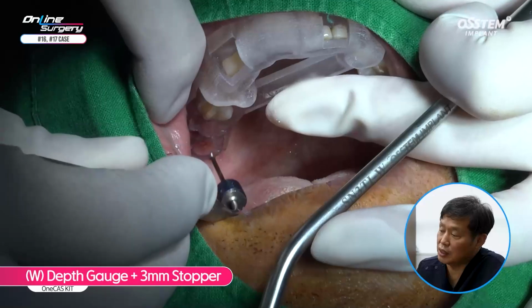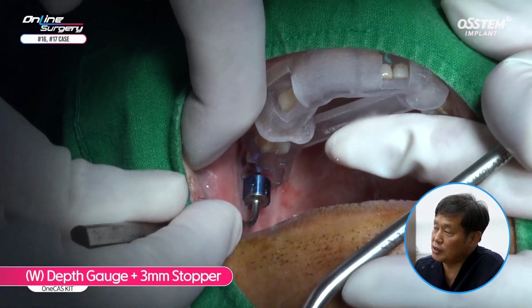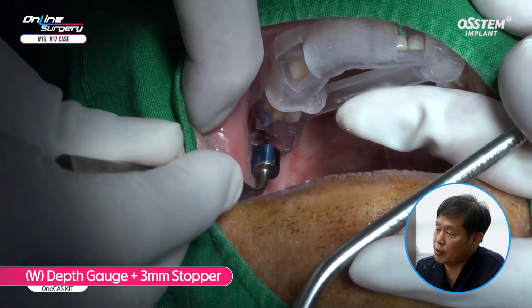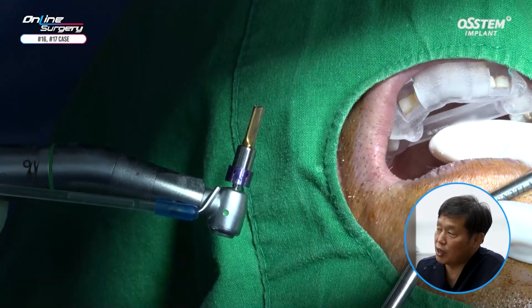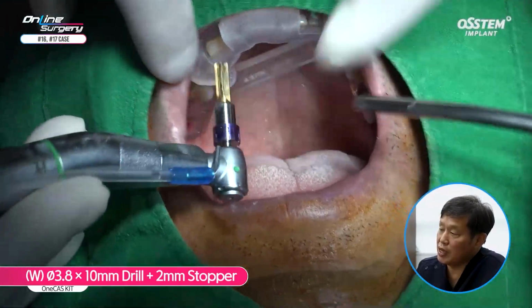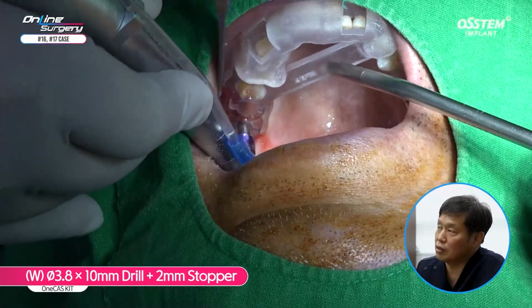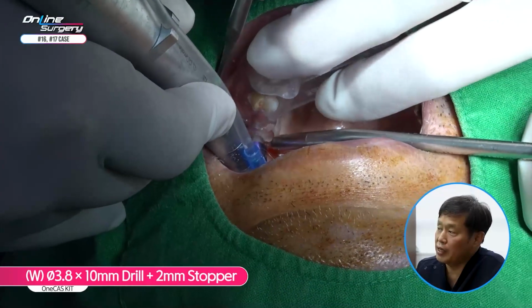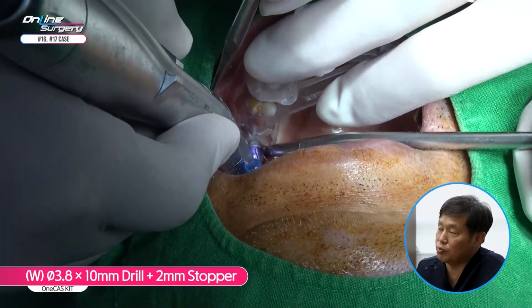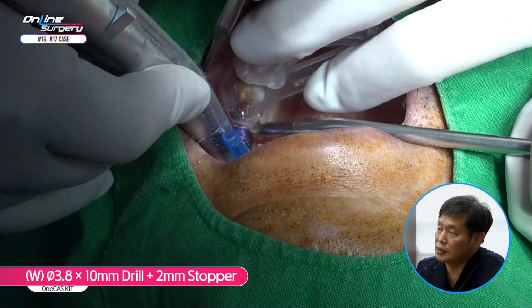A 3.8 drill is used as the final drill. With the 7 millimeter drilling done, a 3 millimeter stopper is used to check whether sinus floor penetration is done. You can see that the template is not in contact. The 3.8 by 10 millimeter drill with 2 millimeter stopper is used. This is the final drill, and drilling is done up to 8 millimeters.